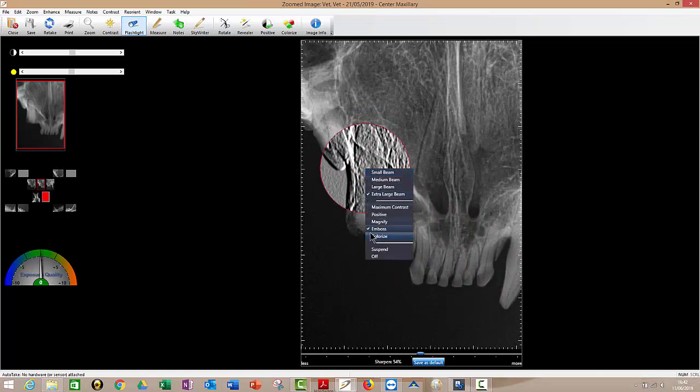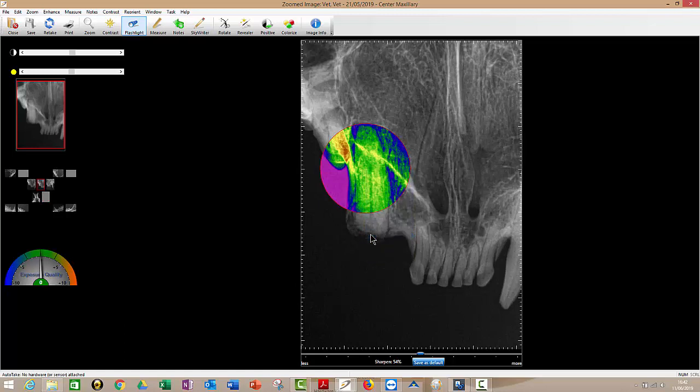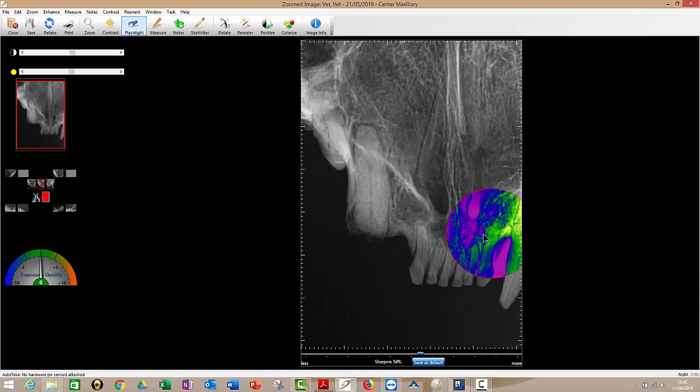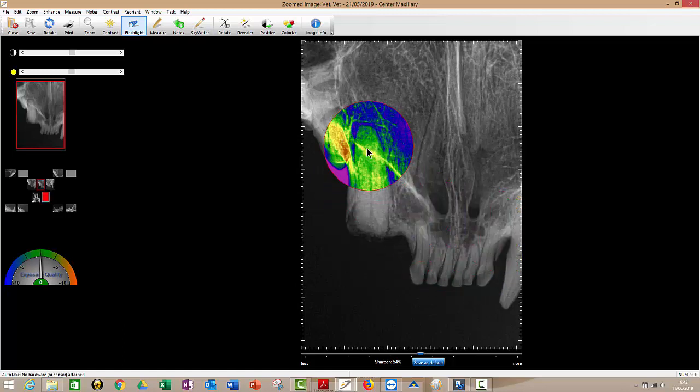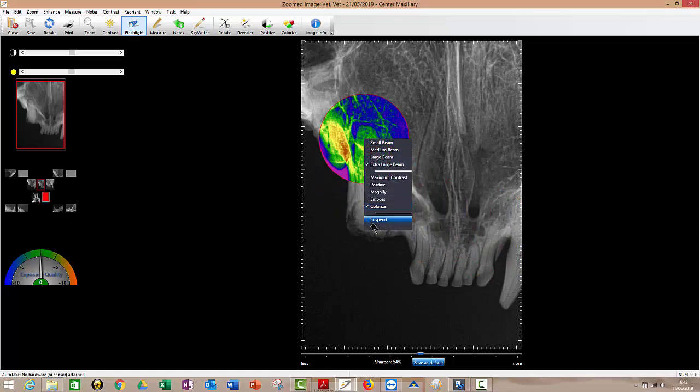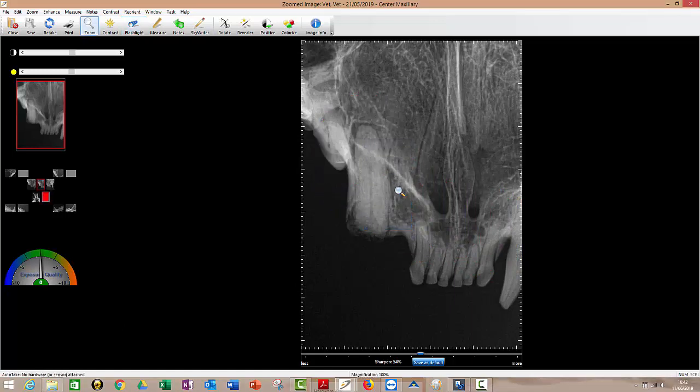Right click again. Colorize. Perhaps limited value in a veterinary practice. Human dentists use this sometimes. And then finally, right click again and off. So that's the flashlight disappeared.